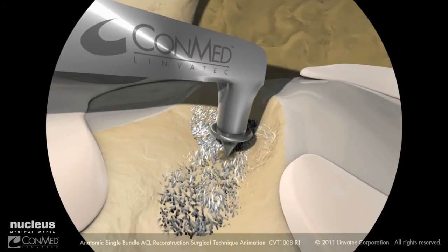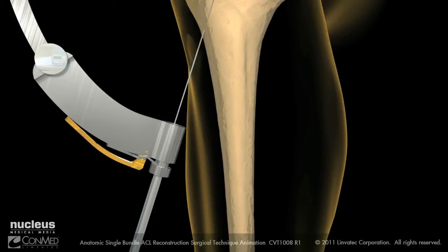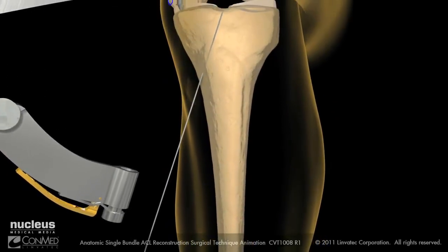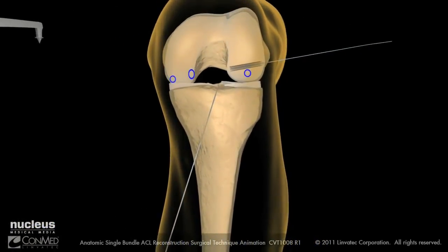Using the ConMed Linvotec M-Power 2 handpiece and pin driver attachment, advance the guide pin until it meets the point of the guide arm. Then depress the pin ACL drill guide lever to remove the sleeve. Remove the pin ACL guide from the guide pin and joint.